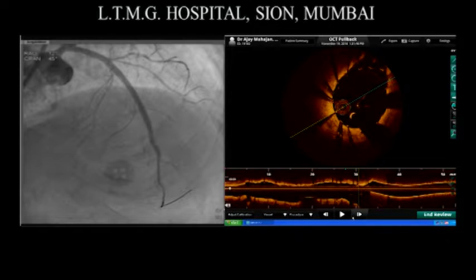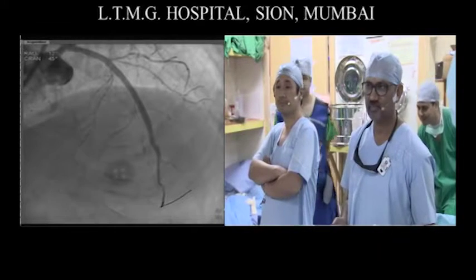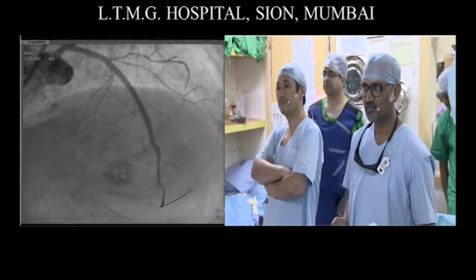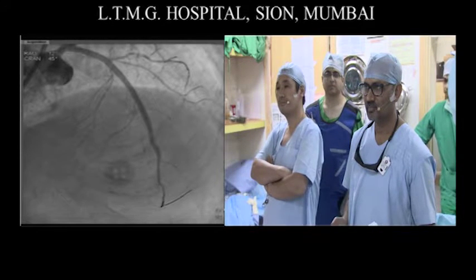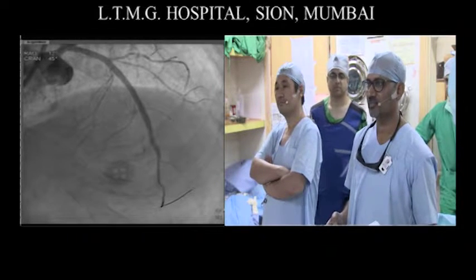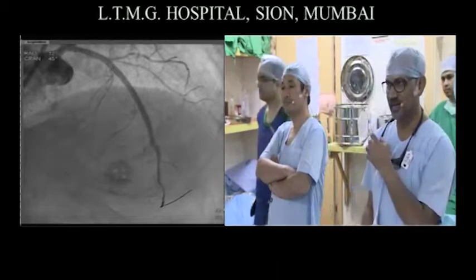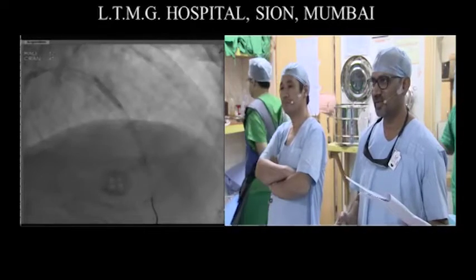I think this is Peter Fitzgerald. Congratulations. That was a beautiful survey of a case you did. One of the things that always fools me is whether the circumflex was actually needed. I couldn't tell angiographically whether it really had a disease burden proximally just because of the angle. At the ostium there is no disease burden, but distally there is a disease. Yeah, no, that's what it appeared to be. At the ostium of the circumflex it is.